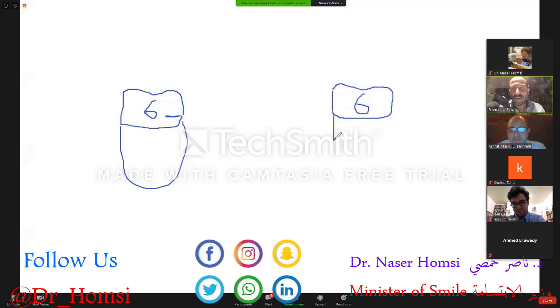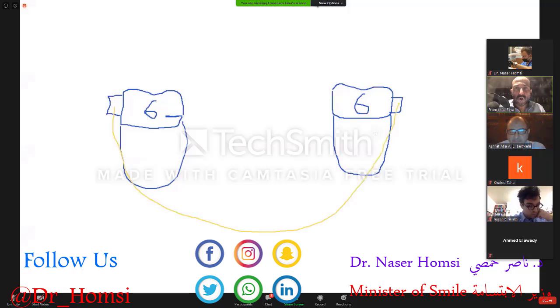I'd like to share a very easy drawing. Here we have, from a frontal point of view, the lower first molars, and an intrusion archwire. I'll draw it in a different color so it's easier to see. We have forces of intrusion that generate extrusion forces on the reaction unit.